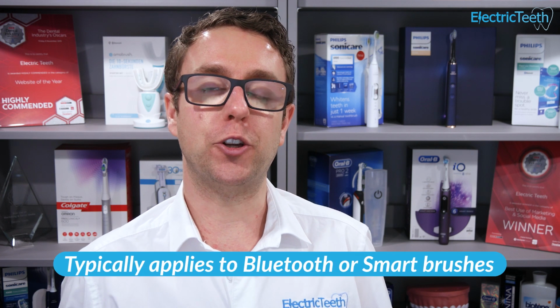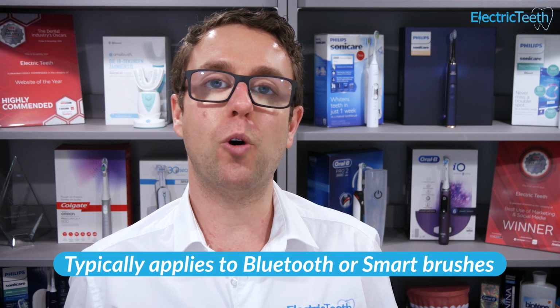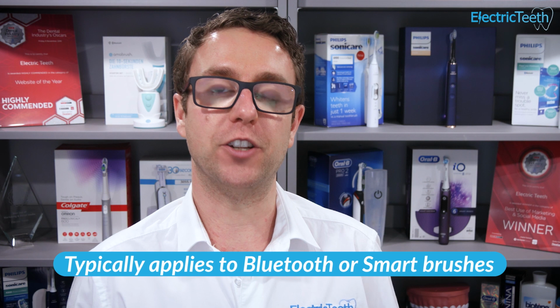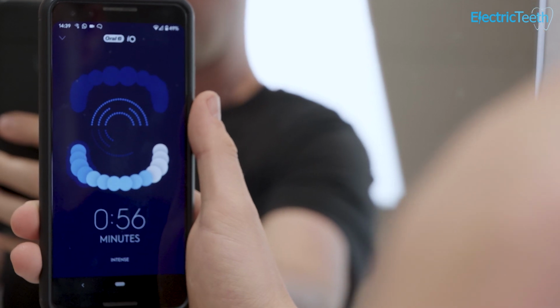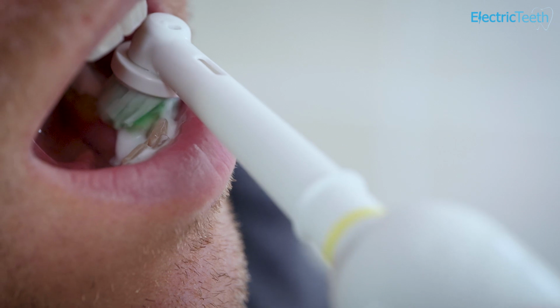Now there are two main causes as to why certain modes may no longer be available on your electric toothbrush. And this typically applies to Bluetooth or smart enabled Oral-B toothbrushes. If your Oral-B brush isn't Bluetooth enabled and a mode is no longer available, you will need to contact Oral-B. But assuming your Oral-B toothbrush is Bluetooth enabled or a smart toothbrush, then these are the likely causes and resolutions to your issue.